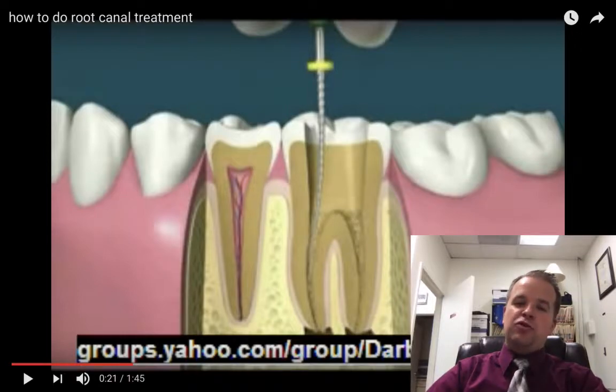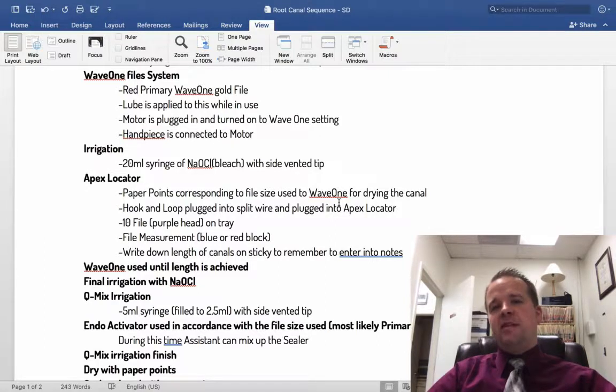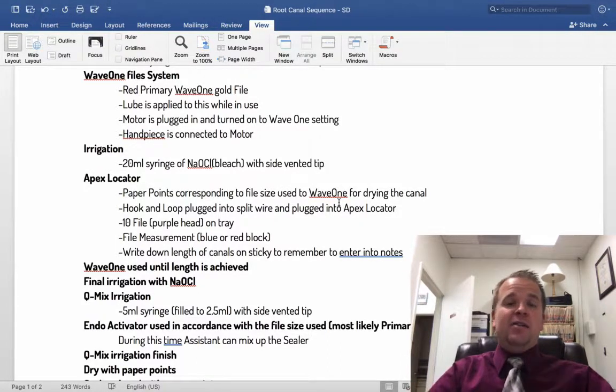And then at this point, you'll dry the canal just a little bit, and you'll use small little paper points to dry the canal. Then you'll hook up the apex locator. The apex locator will be used to find the length of the canal. Once he finds the length, he or she, the dentist, will tell the patient experience specialist, hey, listen, this is how long this canal is, or this canal, or this canal. And you'll write it down, usually, or take mental note of the length of the canals so that you and the dentist can remember how long these canals are.